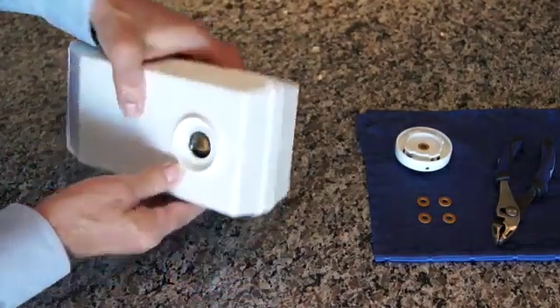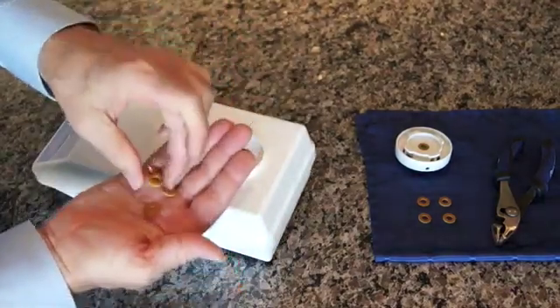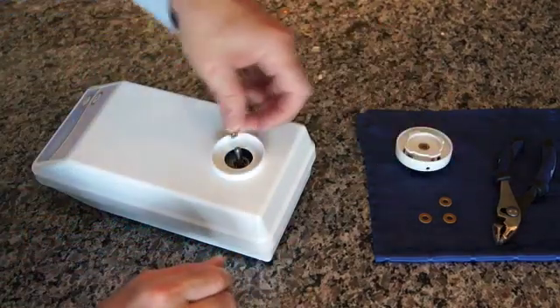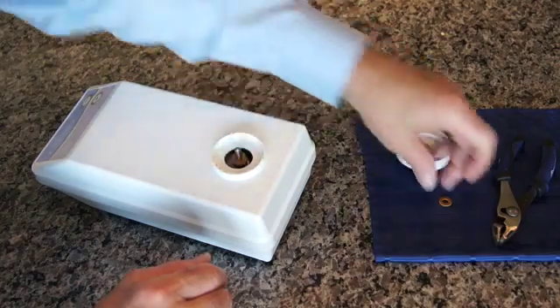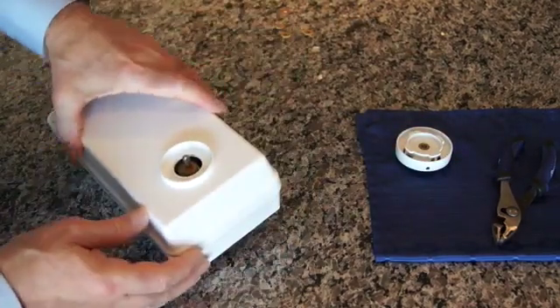There are 4 space maintainers inside the machine, and by turning it over on your hand, you'll be able to get those out. If not, just pry them up and remove them. In the new kit, you will have 4 space maintainers, which keep the hub distant from the case. Place them inside.